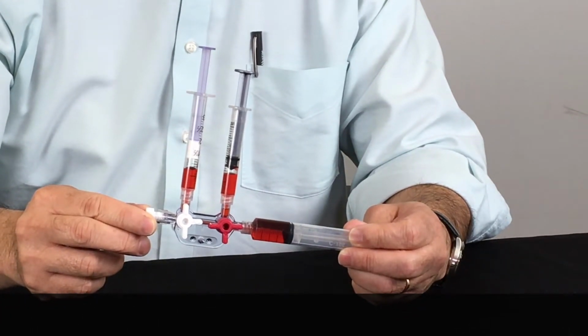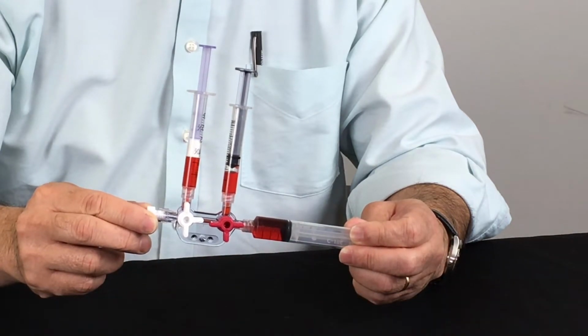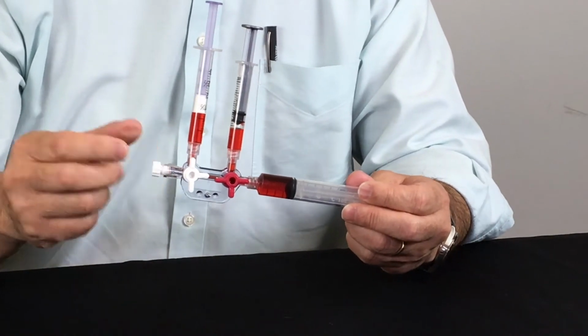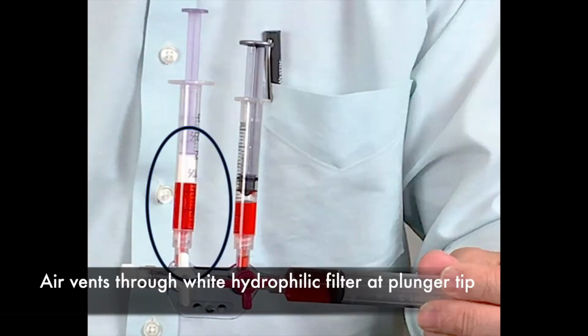And once I've obtained the desired amount of sample volume, the syringe filter swells and automatically shuts off, and as you can see, there is no air bubble trapping.